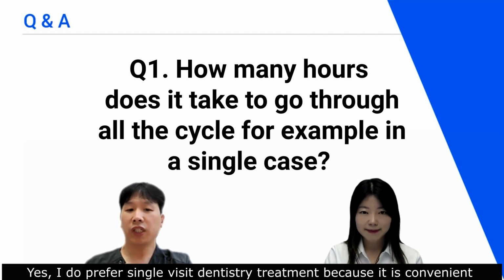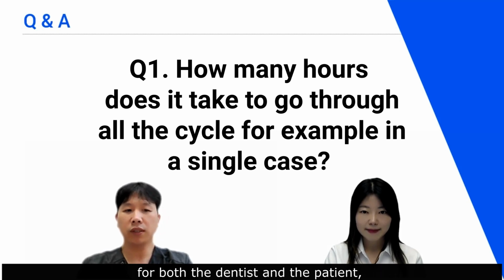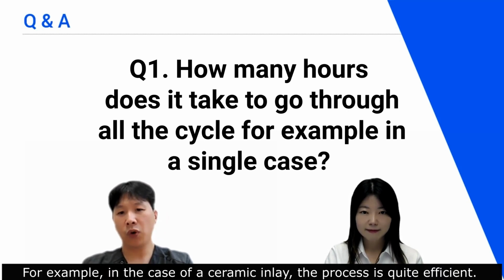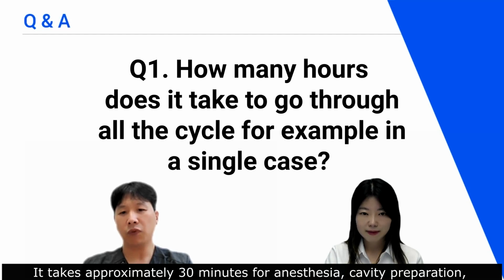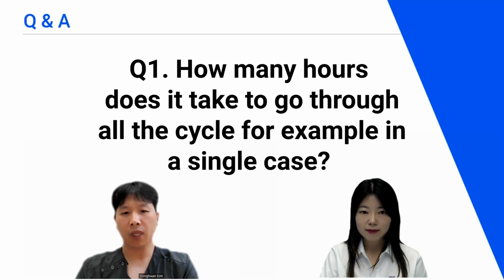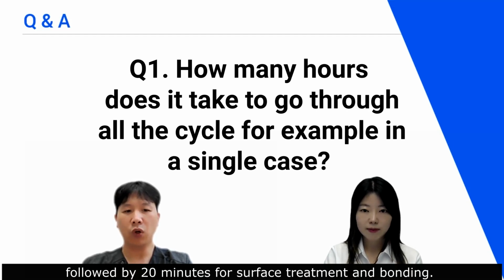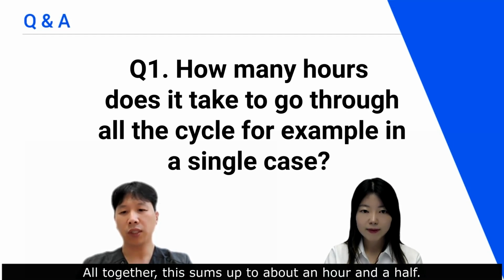Yes, I do prefer single visit dentistry treatment because it is convenient for both the dentist and the patient, reducing the need for multiple appointments. For example, in the case of a ceramic inlay, the process is quite efficient, approximately 30 minutes for anesthesia, cavity preparation, and the intraoral scan. The design and fabrication of the inlay take around 40 minutes, followed by 20 minutes for surface treatment and bonding. Altogether, this sums up to about an hour and a half.